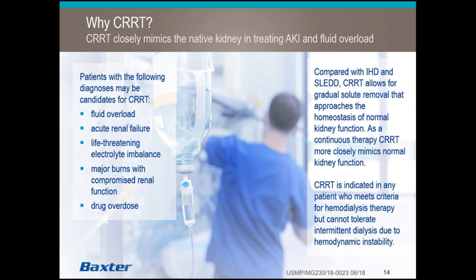imbalances. We discussed briefly replacement solution and how it is an addition to CRRT therapy and that it targets larger molecules in the patient's bloodstream. So patients with conditions like burns or drug overdoses or other conditions where they're producing larger inflammatory cytokines, in some cases CRRT therapy may be more appropriate for these patient considerations than intermittent hemodialysis or SLED.